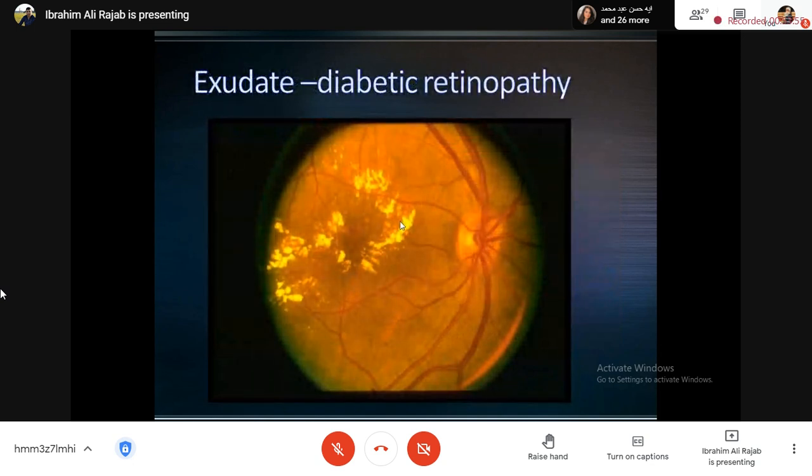يلا أماني صديق, describe this image. نعم دكتور. First, we have a clear margin of optic disc. The cup to disc ratio looks normal.